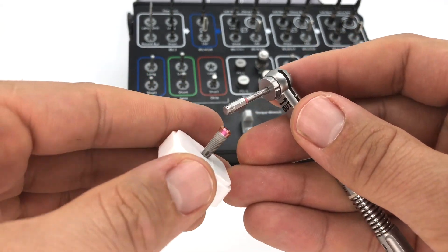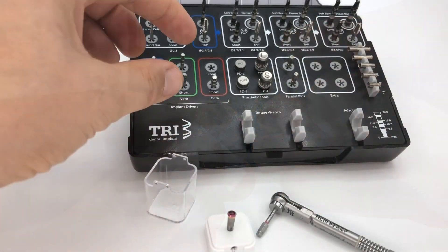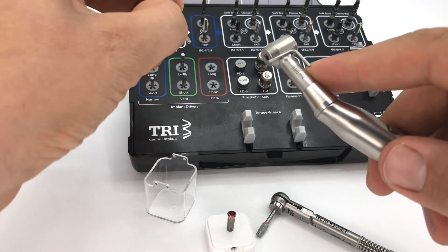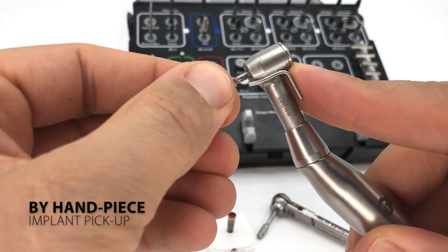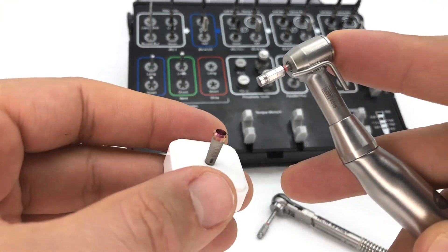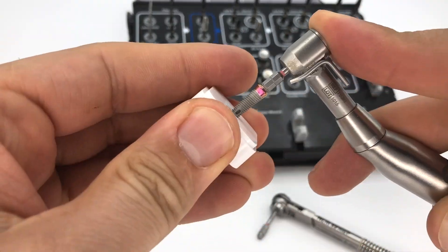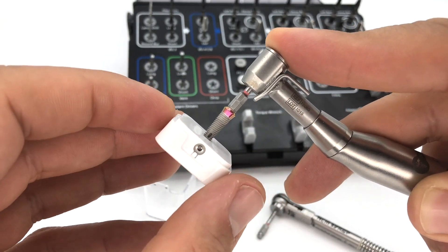Second, by torque wrench: connect the adapter with the implant driver into the torque wrench and pick up the implant from the tripod. Third, directly with the handpiece: connect the implant driver into the handpiece and pick up the implant from the tripod.